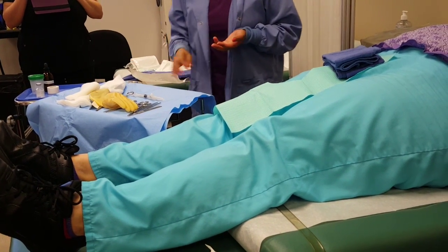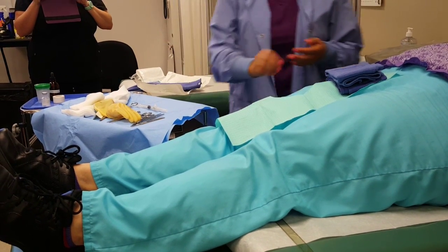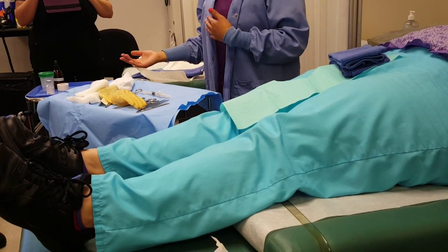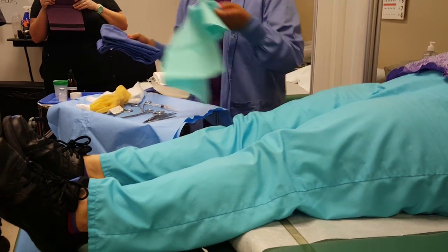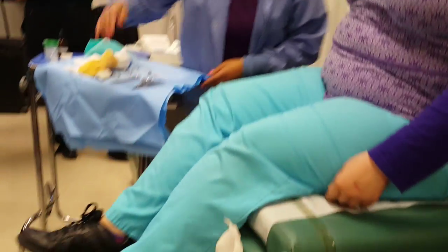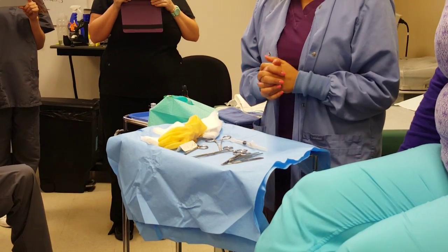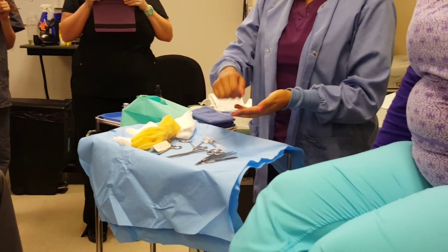Your job is to be there to assist but stay out of the way so the doctor can remove whatever needs to be removed. Once the patient leaves, the room is a mess — that's what it looks like after a procedure. Now Miss Newman has to come in carefully, put all sharps into the sharps container, and take the scalpel blade off the scalpel before putting it in sharps.